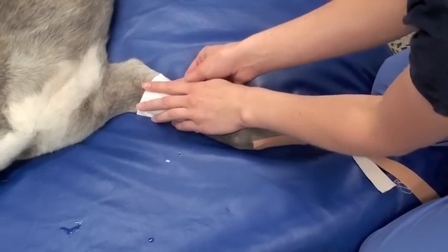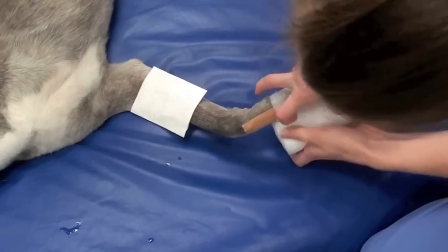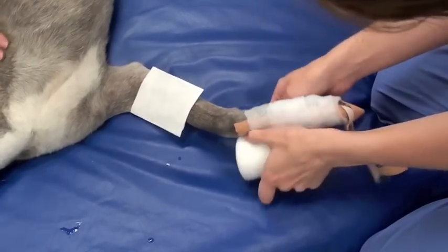We put a non-adherent bandage over the open area of the wound, and any one of the non-adherent bandages will work. I prefer a dry non-adherent bandage like a Telpha pad or Melolin or something like that.